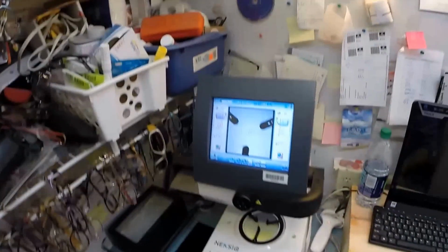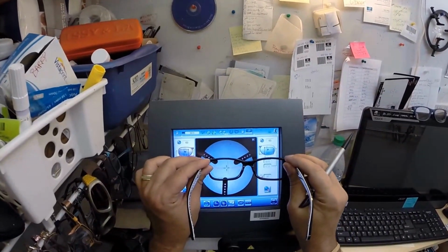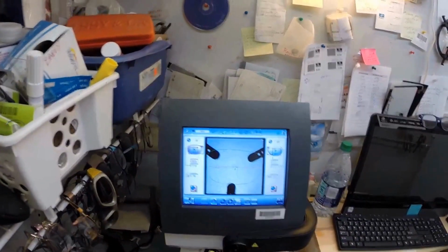Carolyn, you know you need prescription. So that is the shape of your lens, only magnified. I'll bring it down to the actual size. There we go. I'm going to bring it back up while we work on it.